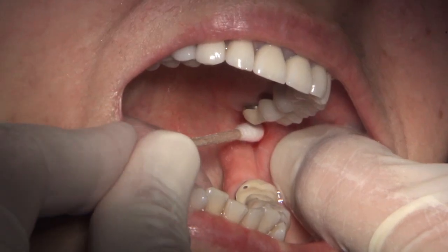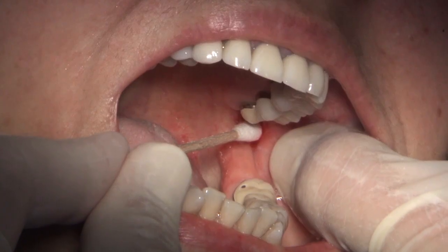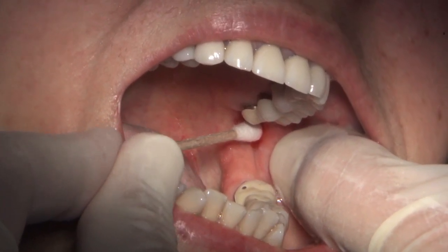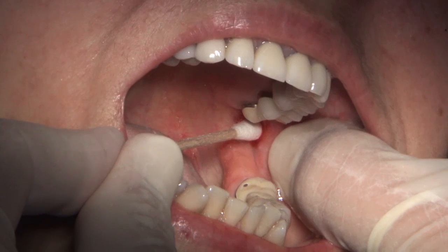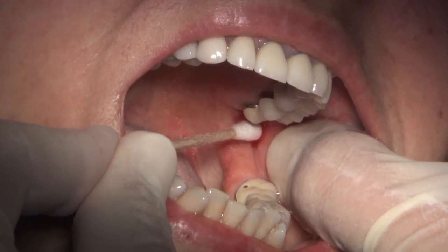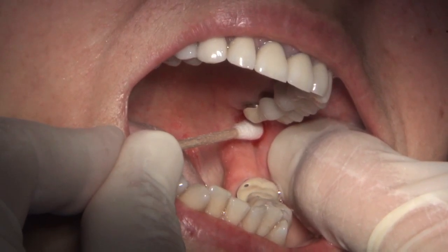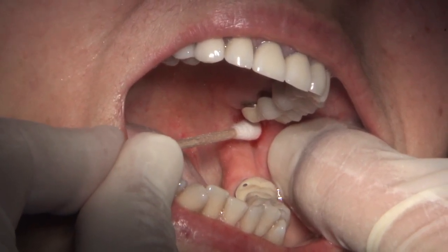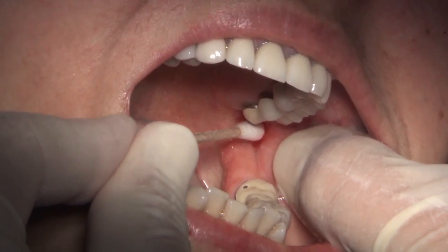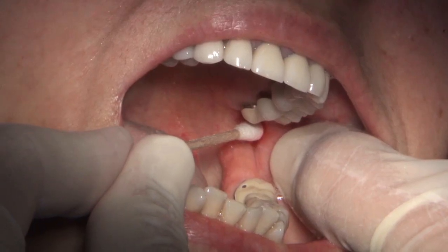Since we're going to be doing the twizzle and keeping everything nice and straight, it really doesn't matter where we put the bevel. In fact, we're not exactly sure where the bevel might end up anyway, but it almost doesn't matter because we're going to have it tracking straight because of the twizzling. And that's going to be with all the things we do with the wand — we're doing bi-rotational. So for bi-rotational, I'm going to grab it a little farther back because it's for a block and not for an infiltration.